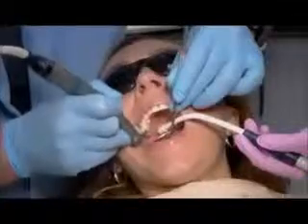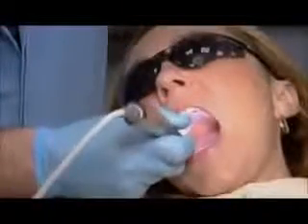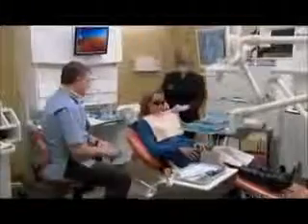Finally, the dentist polishes the contours of the ceramic inlay. And it's time for the reveal. He uses the camera to magnify the new dental work for the patient's scrutiny. It's taken just an hour and a quarter for her custom restoration to be designed, milled, and installed, all thanks to digital dentistry.